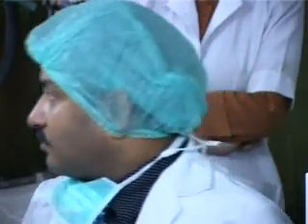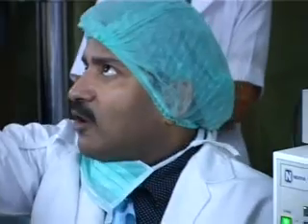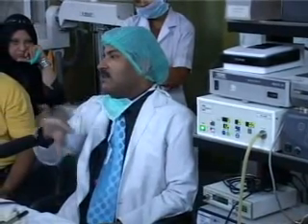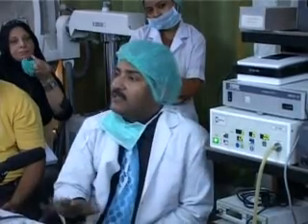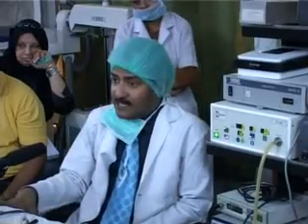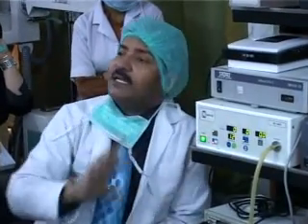How do you change the preset pressure? Just go plus or minus. If you go to the minus, the column will come down. And if you keep the plus, then this column will go up. And when you remove your hand, it will come to 0. That is the actual. Or if it is inside the abdomen, then it will show you the actual. So it is hidden. But this is known as the quadromanometric indicator. Quadro means 4 and manometric means pressure. The quadromanometric indicator is recommended and is a must-have indicator for all medical grade insufflators.